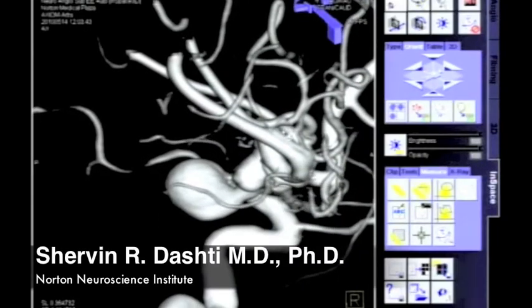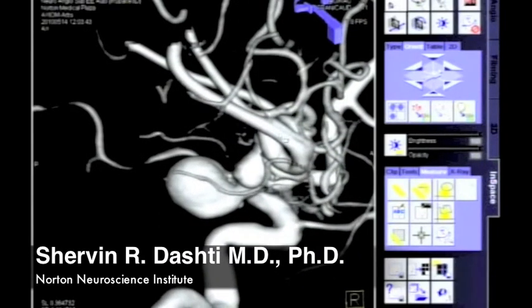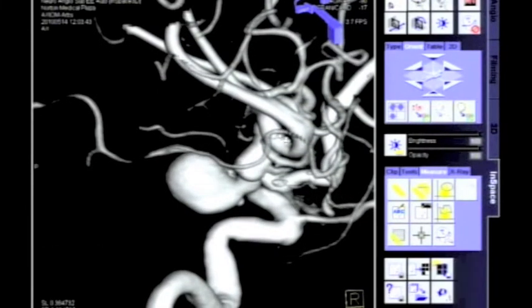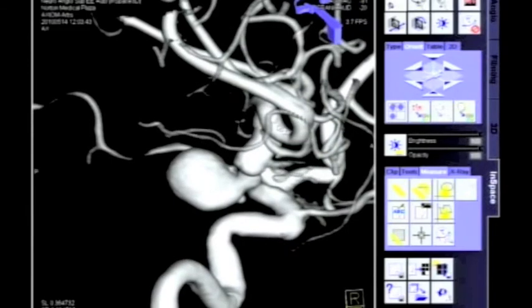Here we are looking at a three-dimensional angiogram of a large PCOM aneurysm. By manipulating this rotational model, we are able to come up with the proper working angles to treat the aneurysm.